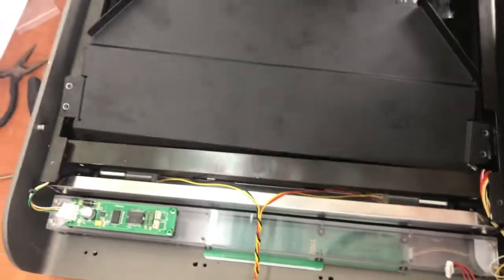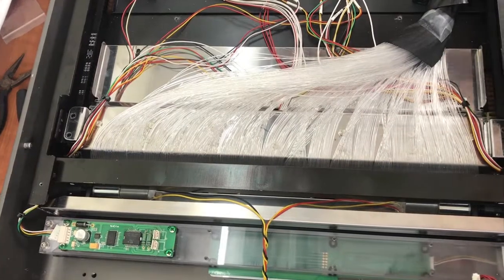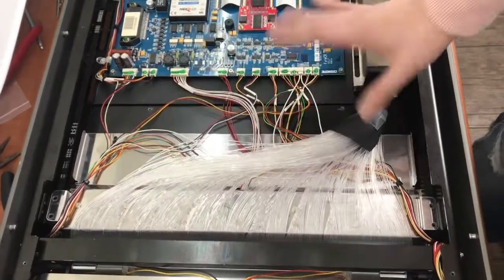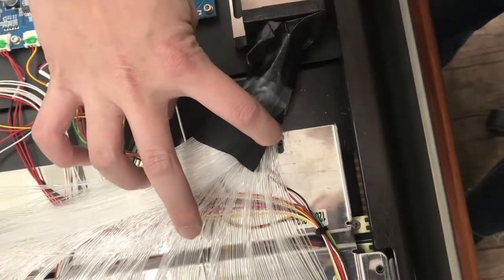After opening the unit, just take off the display cover. Then you can see the PMT is connected, and the erasure board is here. There are two screws for the erasure board — one and two here.